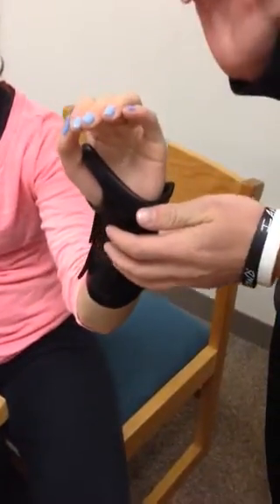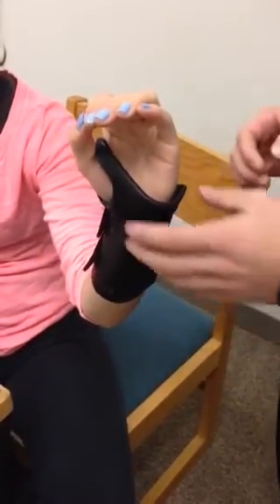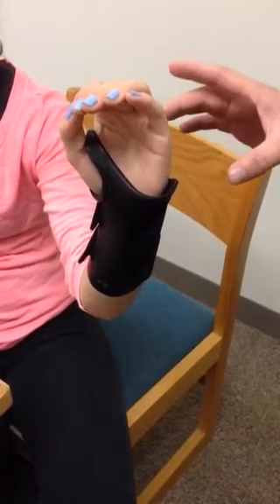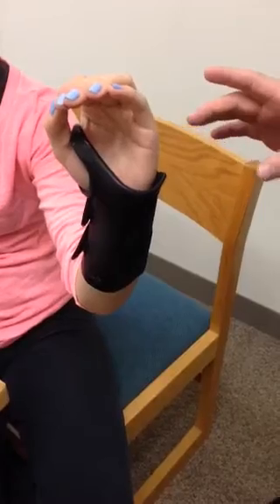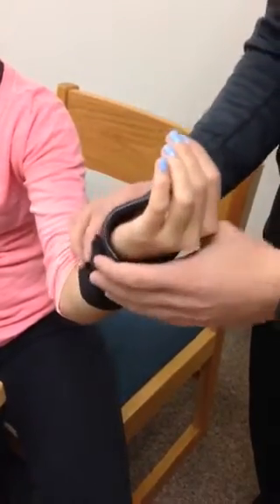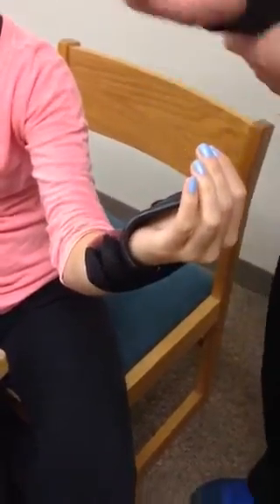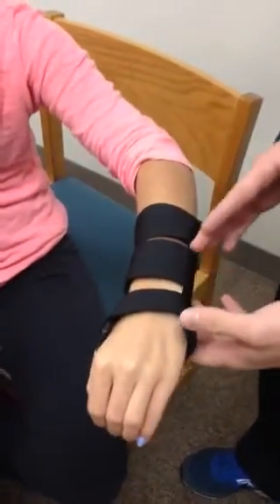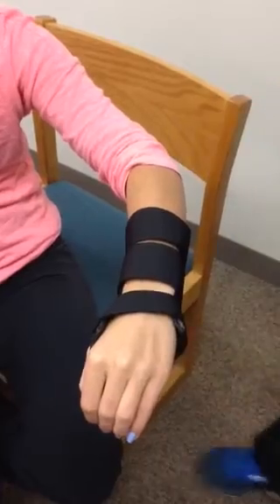We're going to stabilize the patient with 20 degrees of wrist extension, and we want to make sure to cover both the radial and ulnar styloid process. The dimensions of this wrist cock-up splint should be half the circumference of the forearm and two-thirds the length of the forearm.